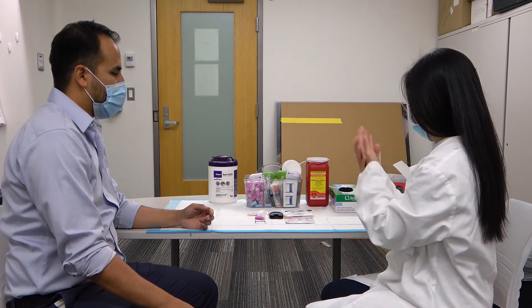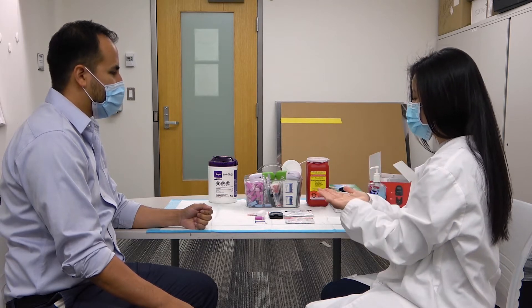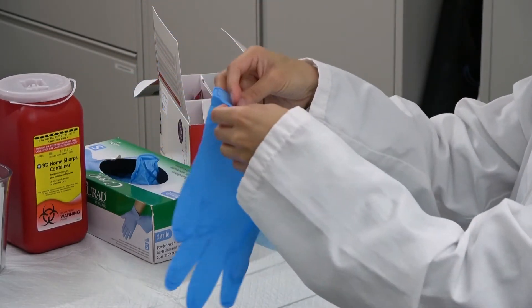Apply hand sanitizer and allow to dry. You may don gloves or any additional personal protective equipment required or recommended.